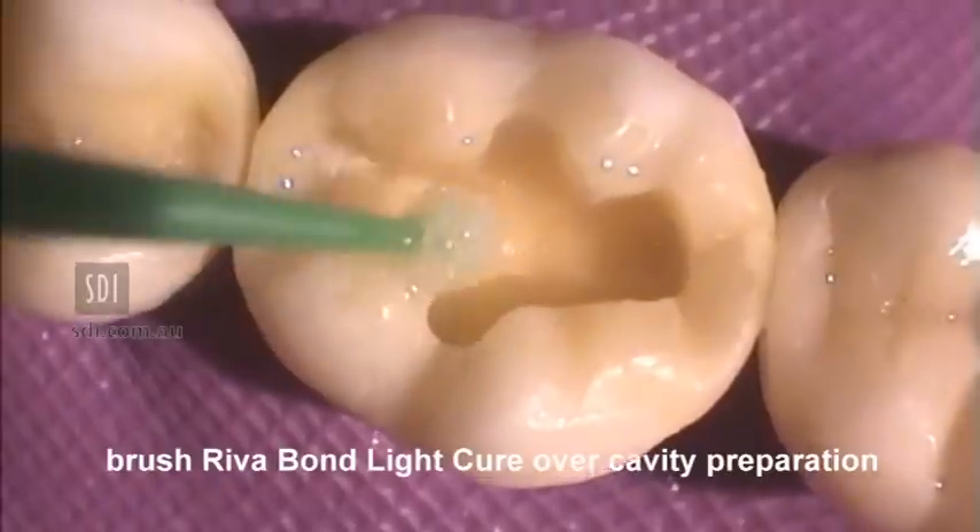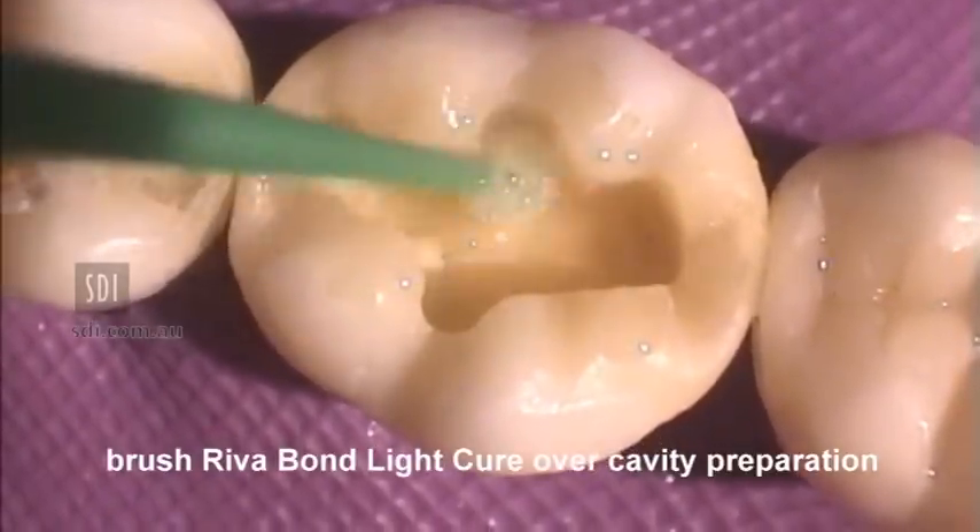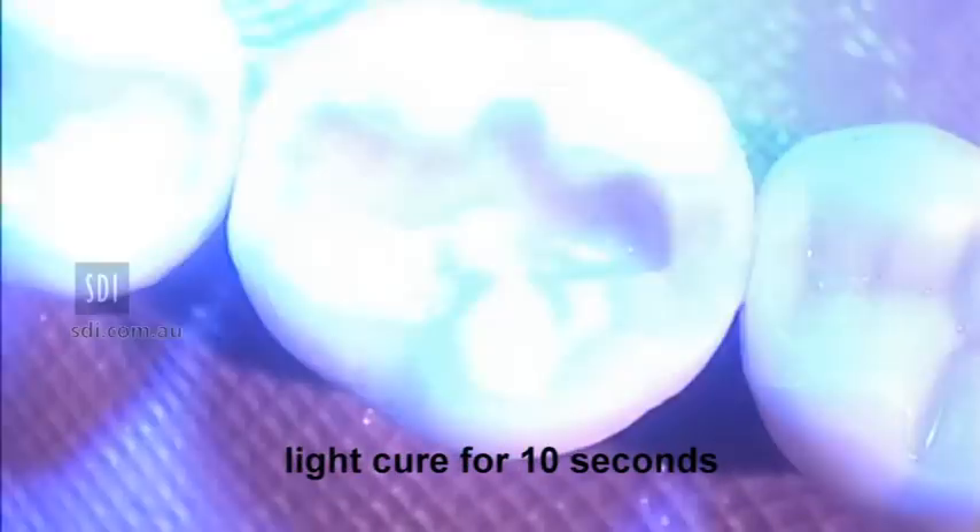Apply RevaBond LC over the cavity preparation and adjacent enamel surfaces. Light cure for 10 seconds.